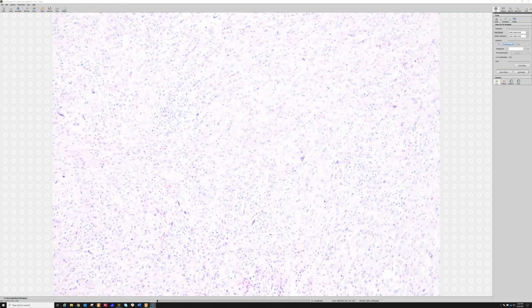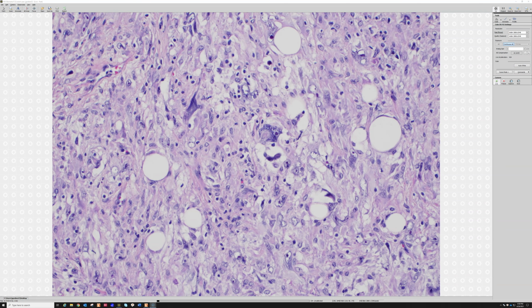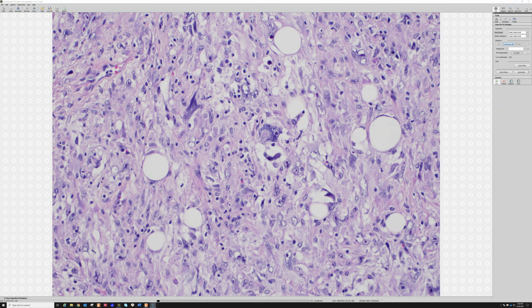All right, we've really hit on all of those points. And again, you can go watch the longer video if you need some more information. There's some ugly pleomorphism there. But this is Myxofibrosarcoma. Be on the lookout because you will probably encounter this tumor at some point during your career, maybe even multiple times.